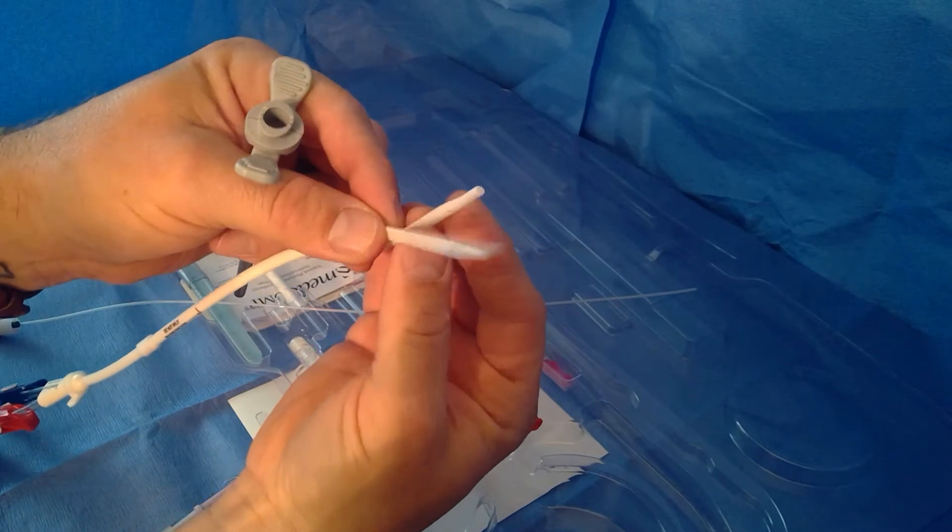Another quick tip: when you take these and you're going to feed them into the peel-away, there's a valve in this peel-away. You want to make sure that you take the catheter, pinch it together with your fingers, make sure that it does not crisscross like that—that'll cause a problem. Make sure it's not turned on itself or reversed; that will cause a problem. It needs to be smooth, just like when it came out of the package.